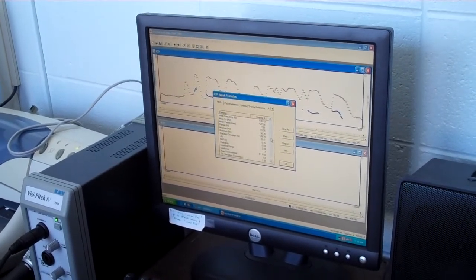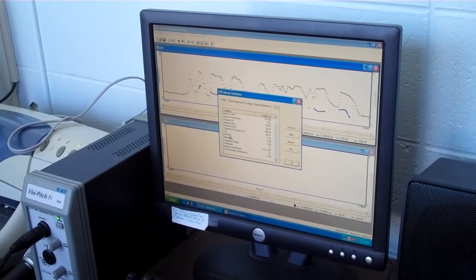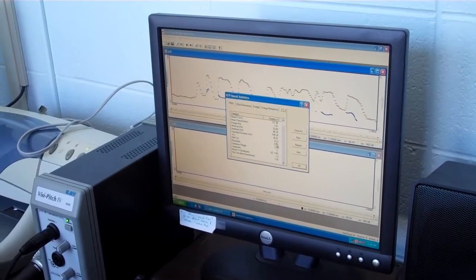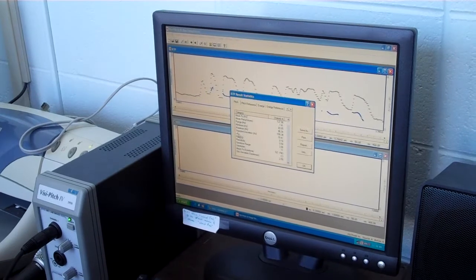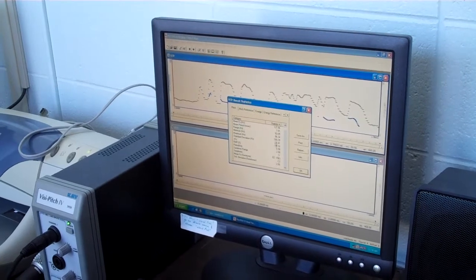A second measure you want on there is something referred to as jitter. Now if you look down here, you don't see jitter at all, but what you want is this one that says RAP percent, R-A-P percent. In this case, it's actually 0.58 or 0.58%. So that's the figure that you want to do. And again, you would record that figure and then tell whether that's within normal limits or not.